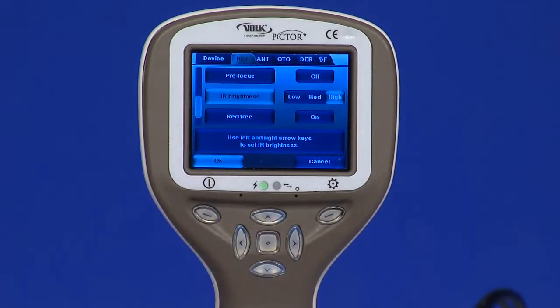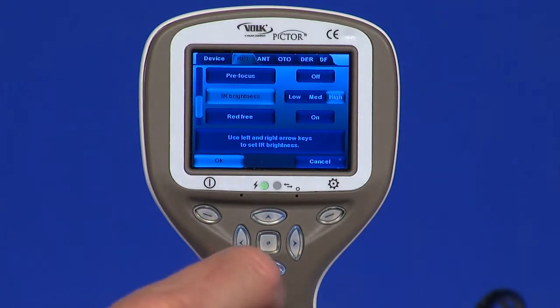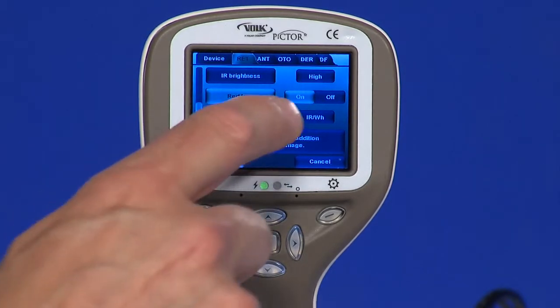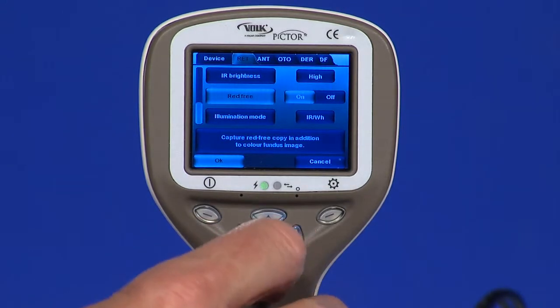IR brightness. Infrared illumination brightness has three levels: low, medium, and high. High is recommended. Red free: if red free image is enabled from the menu, the camera will save a picture using a green channel in addition to a standard image.